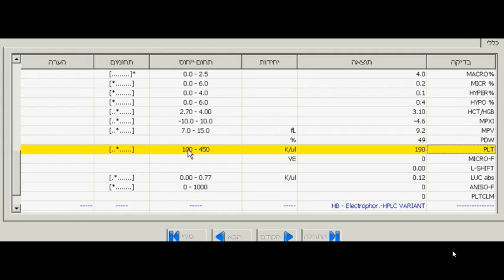And then again, what will you do if you find clumps? It's not really clear. It's not going to change any medical decision. At least it shouldn't change any medical decision making.